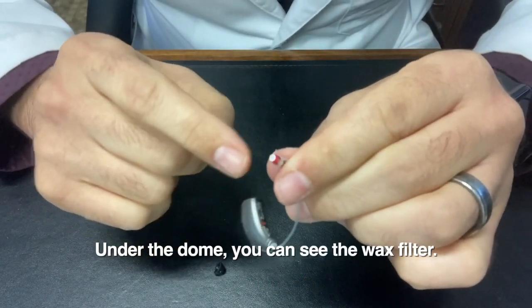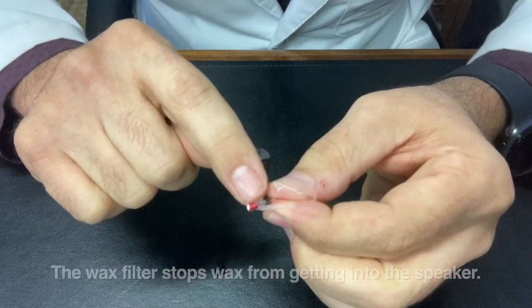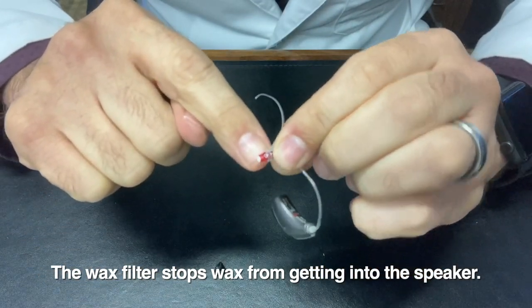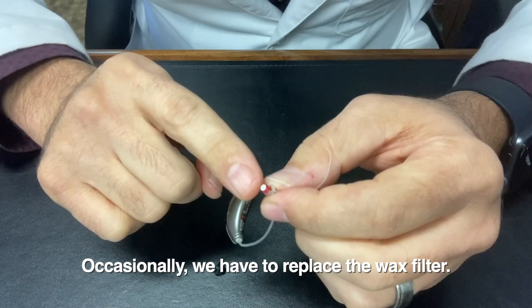Now underneath that dome, there's this white piece here. That white piece is called the wax filter. This is the speaker, the part that goes in your ear, and the wax filter is protecting the speaker. You don't want earwax getting into the speaker because it'll gunk it up and it won't sound as good. So occasionally we need to change that wax filter.